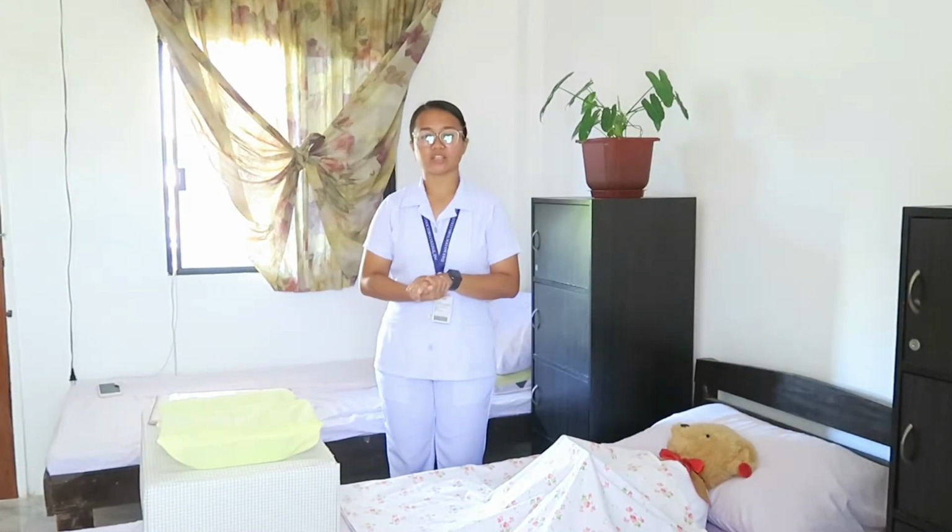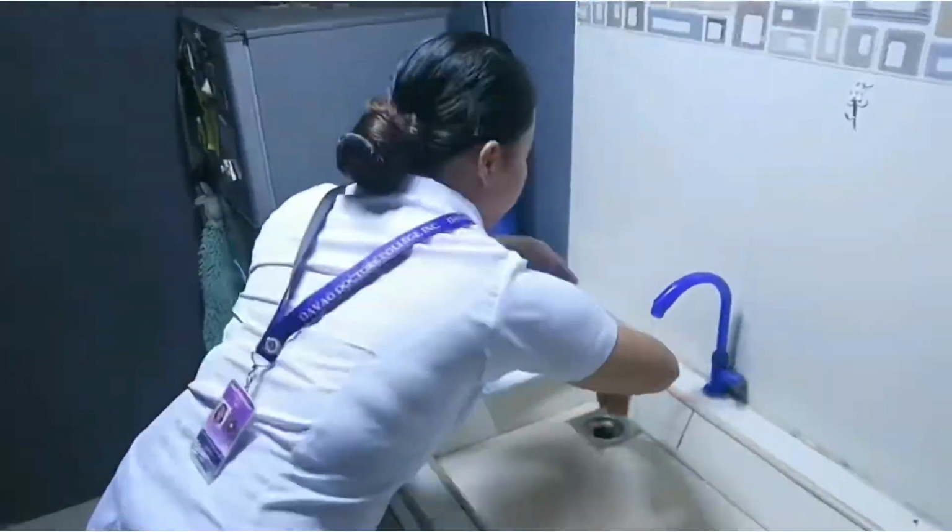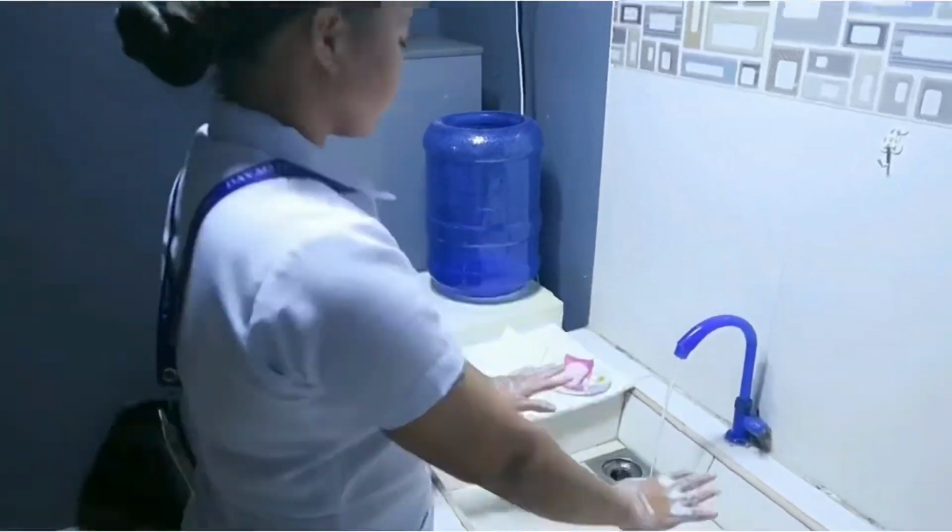And then after checking the doctor's order, you need to perform hand washing before preparing the set. This is to reduce microorganisms that cause diseases and contamination. Now that I have already washed my hands, next is to identify the patient's identity and also introduce yourself. This is to establish good rapport and provide the client opportunity to ask or raise her concerns, and also ask the client how she would like to be called, and also explain the procedure to the patient. This is to gain trust and cooperation from the patient.